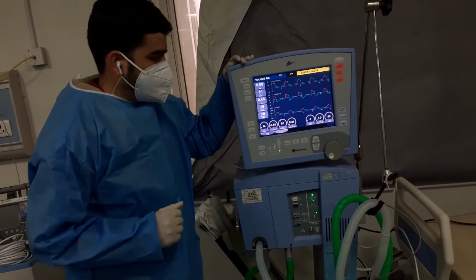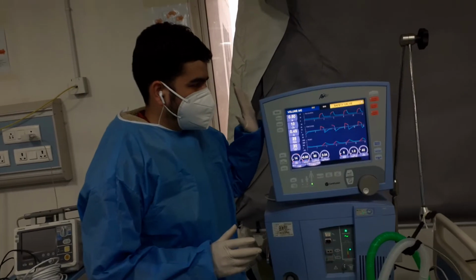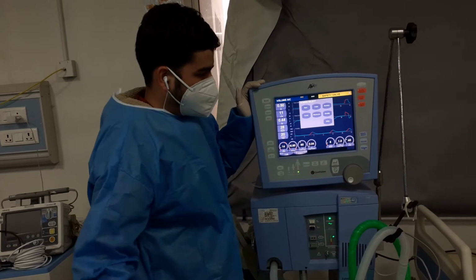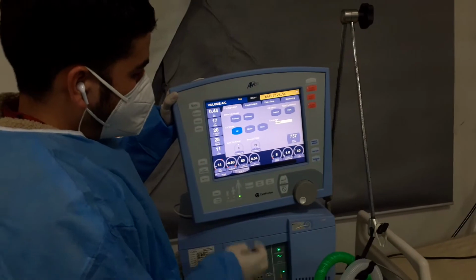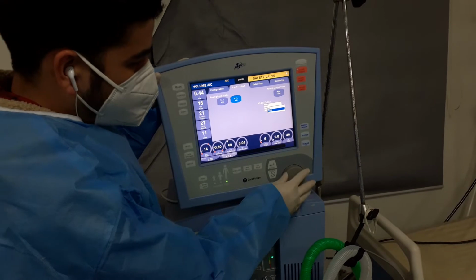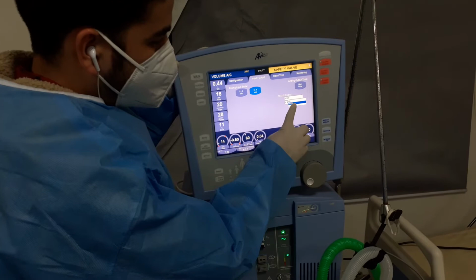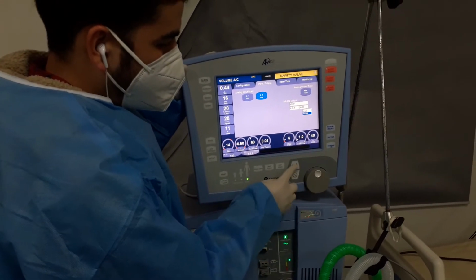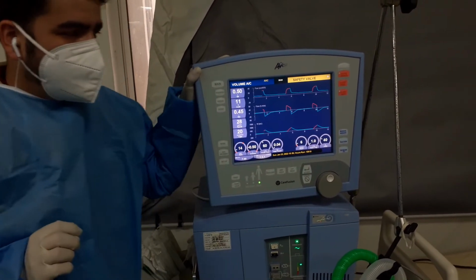Okay, now let's start. Up to now I have demonstrated the various settings we have to make. Other than this, we have to click on the screen button, then click on utility, then input and output, and set the RS-232 here. We can change it by scrolling, and then accept it. We have to change its baud rate to 115200, accept the settings and go to main. These are the changes we have to make.